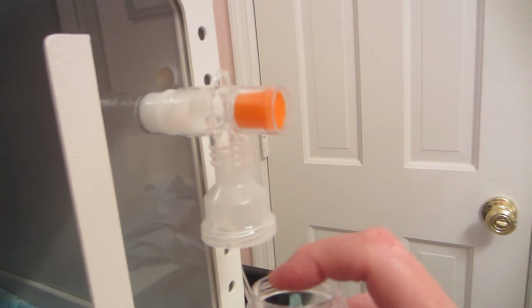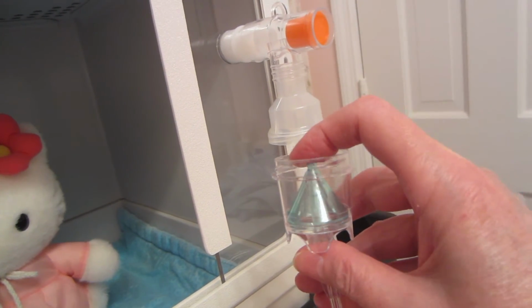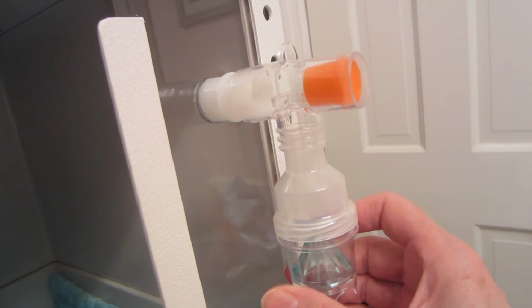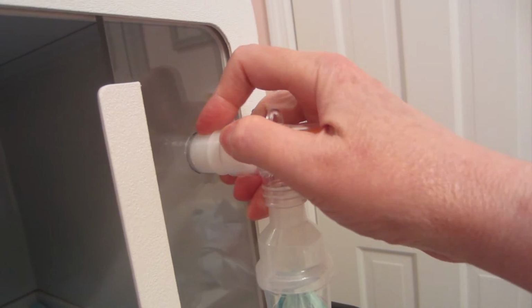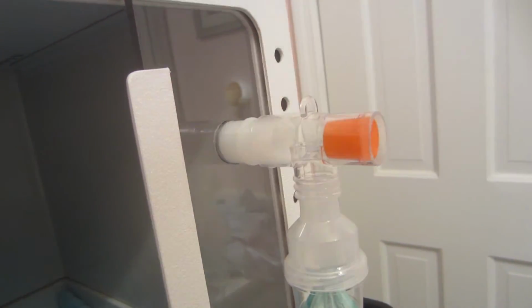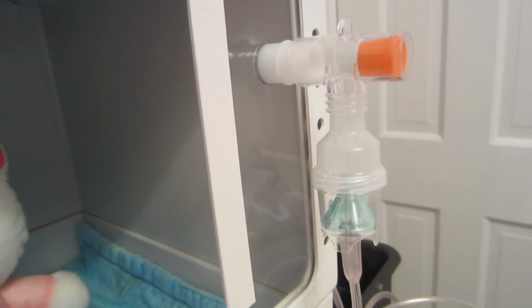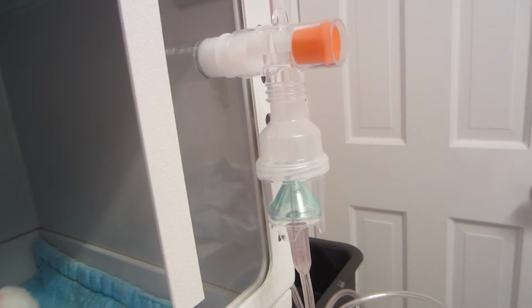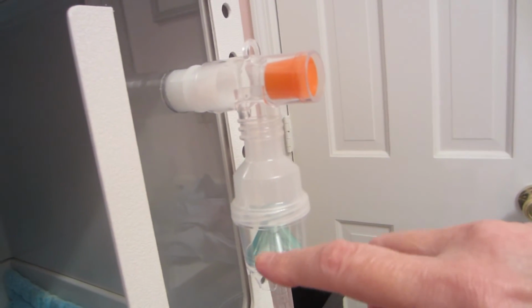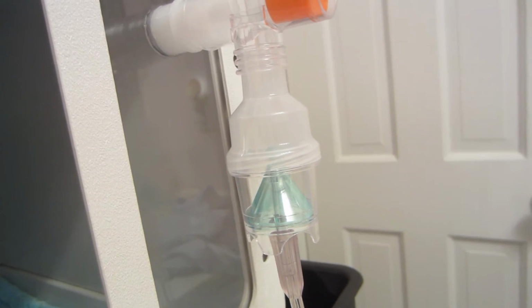So you have all of your medication and your water in the bottom of your nebulizer with the little cone inside, and you're going to screw that on to the rest of the unit. Make sure it's snugly attached to your nebulizing chamber. And then you turn on your compressor. What you will notice is that all the liquid down in the bottom of your nebulizer will start to fizz and bubble a little bit and make a real fizzing sound.